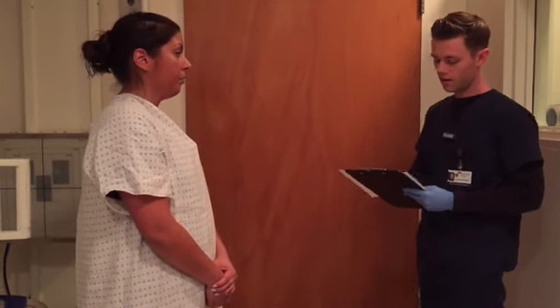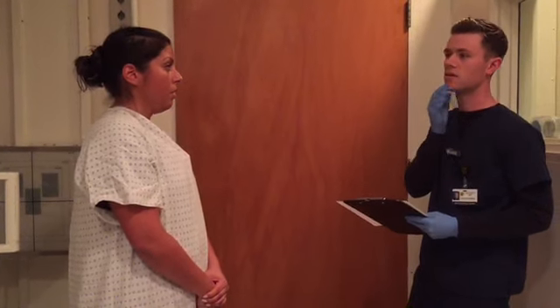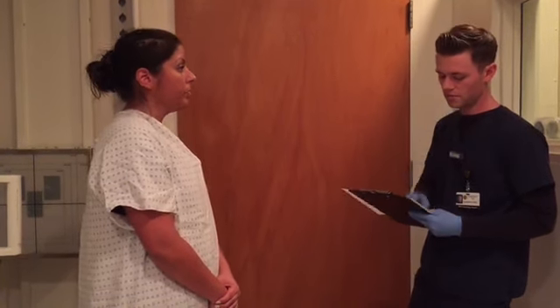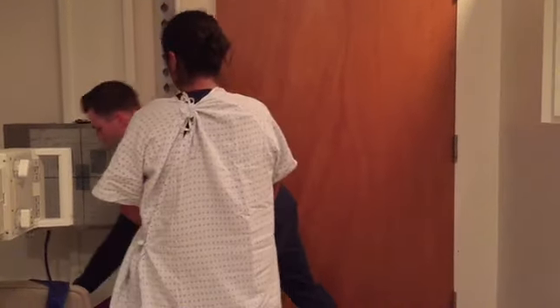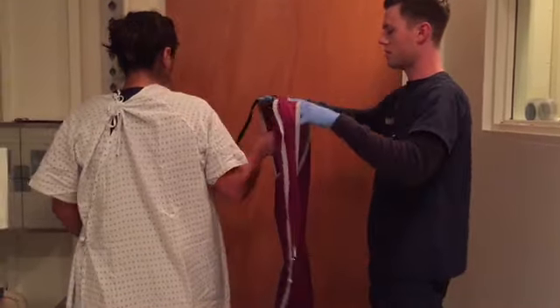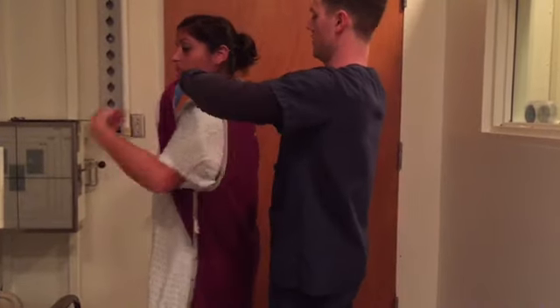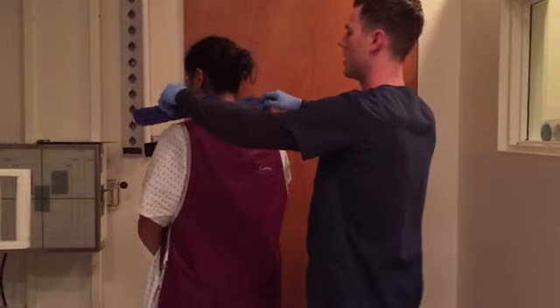Okay, alright. Well, that looks like you're going to be doing some sinus x-rays as well as the mandible. Alright, go ahead and get the shield on here. And before we start, is there any chance you could be pregnant? No. No? Okay, great. Go ahead and place the thyroid shield on backwards since we're going to be starting with the PA projection.